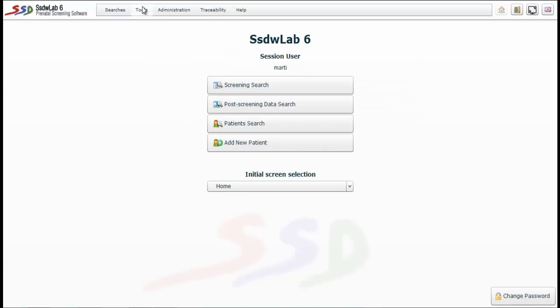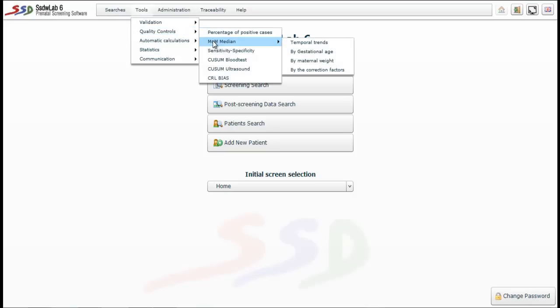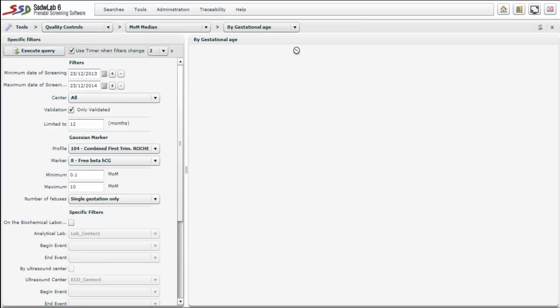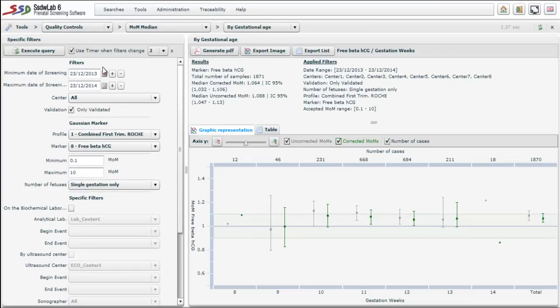From the main screen we select the Tools menu, then Quality Control, then Median Multiples of the Median and the option by gestational age. The controls are very similar to the previous option.